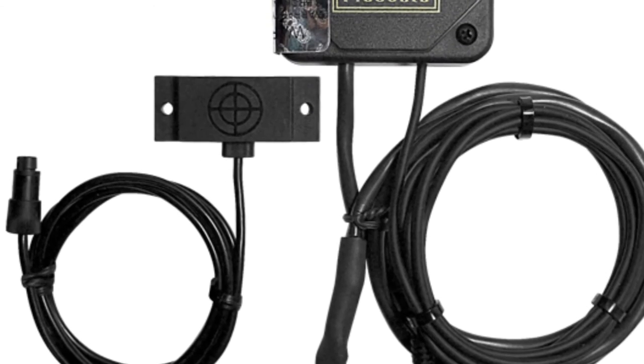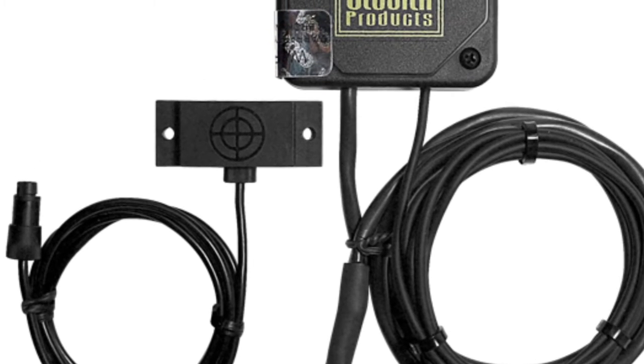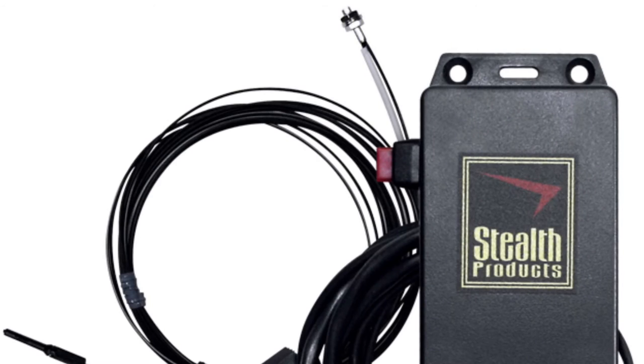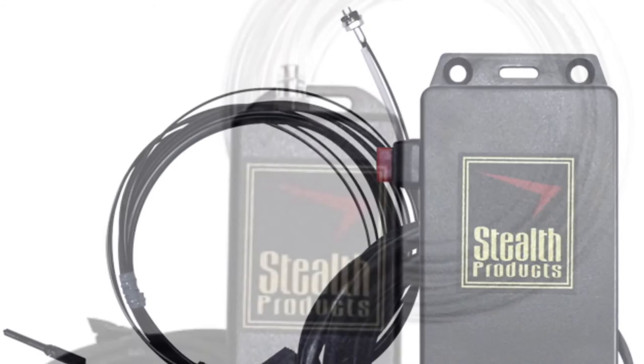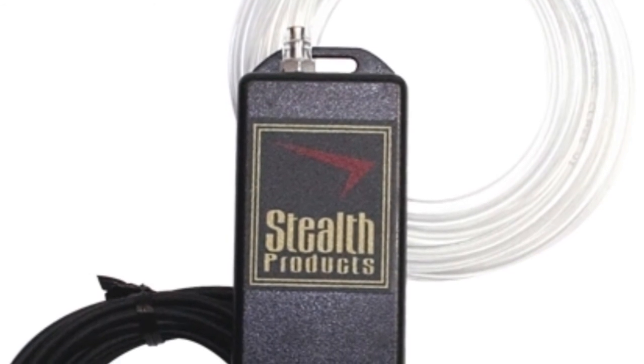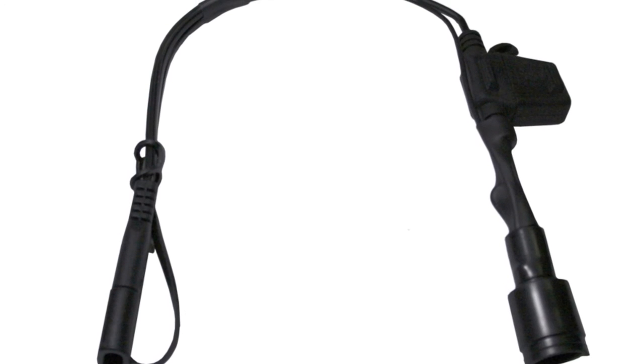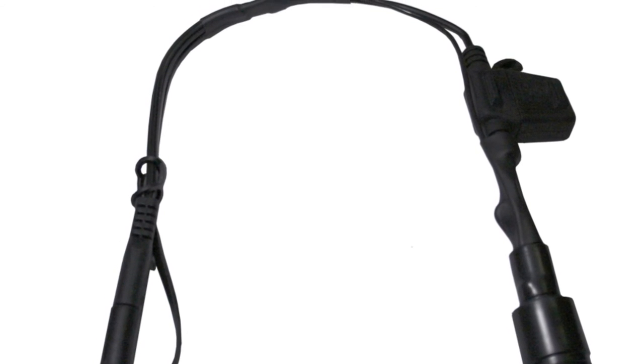We offer many methods of connecting to the Power Swing Away Boom. One of them is proximity sensors. Another would be a fiber optic that you can mount in anything, and also a pneumatic switch. With breath control, you could activate the Power Swing Away Boom. We also offer power sources from Q-Logic, R-Net, and Invacare.